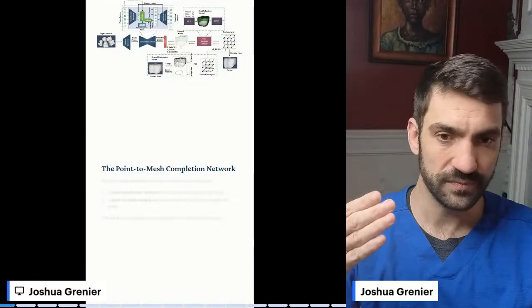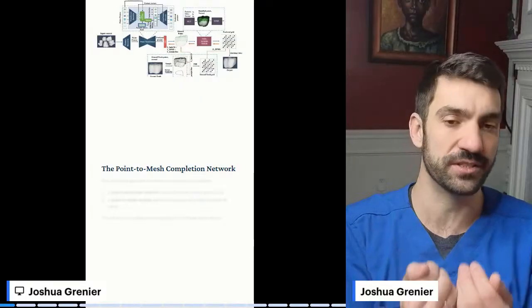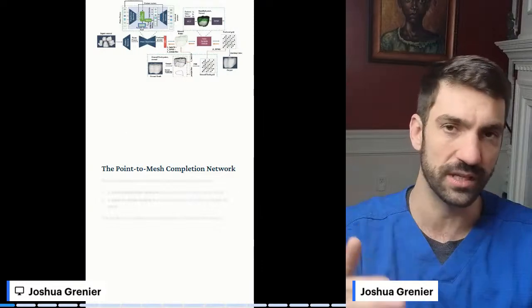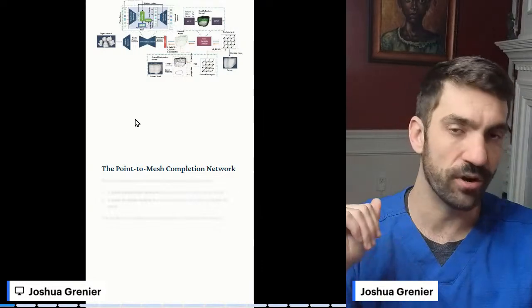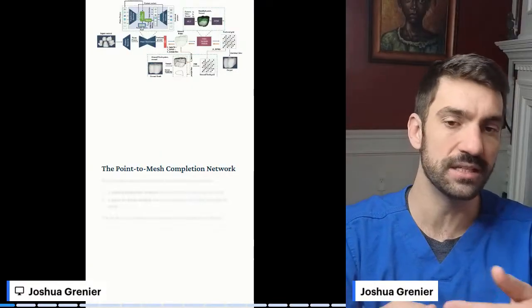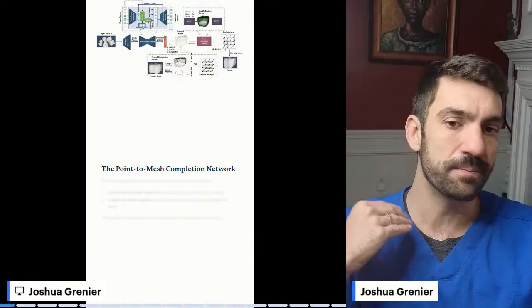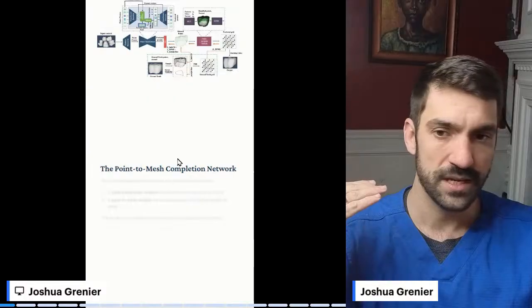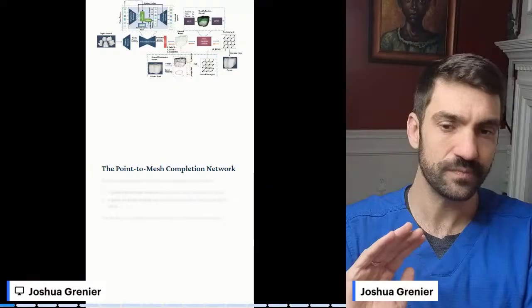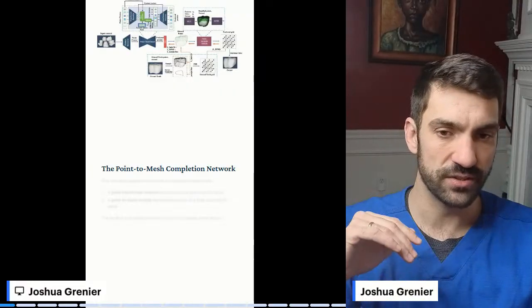Now, this is what even a very basic paper shows. Not that it's basic, but this isn't a paper that actually built this machine, but this is what that type of machine would look like. This is what the neural network that would design a crown would look like. And it's incredibly complicated. And even within that, there are levels of increased complexity. But the basic fundamental idea is that you are feeding your information, your mesh, which is then converted to a point cloud, into a transformer model.